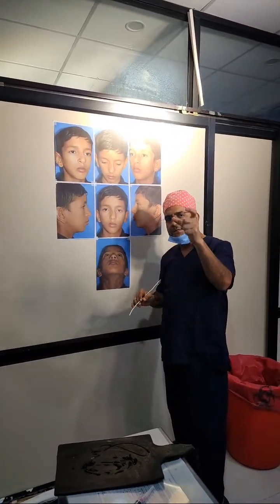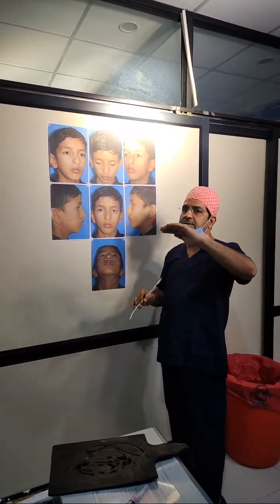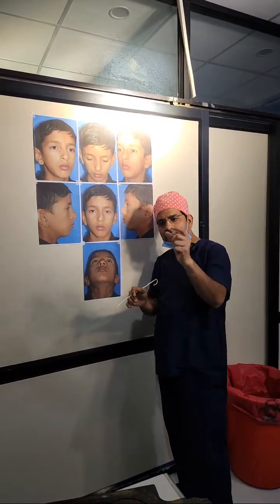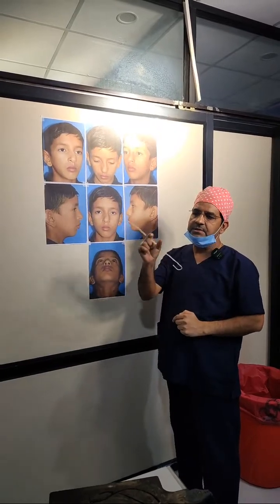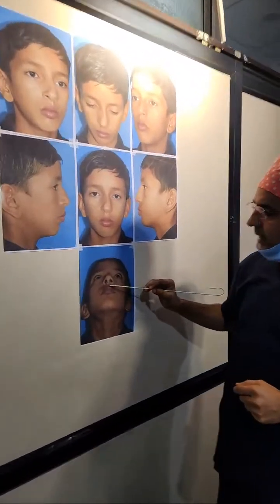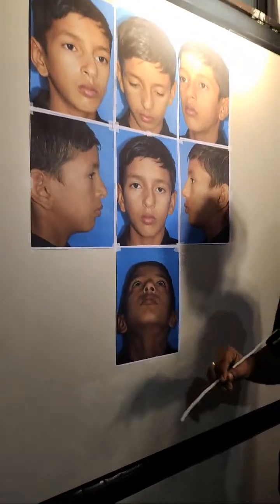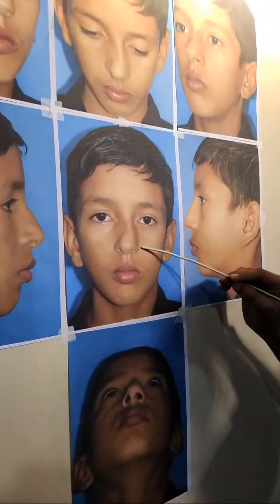If you have an excess part of the dorsal septum or the caudal part of the septum, then you first trim the excess part, and then you do the septoplasty. After the complete septoplasty, you create the L-strut, and then you reposition the caudal part of the septum to the anterior nasal spine with 4-0 PDS suture, properly fixed in the midline. And then comes the osteotomy, because in this patient the osteotomy also plays a key role.